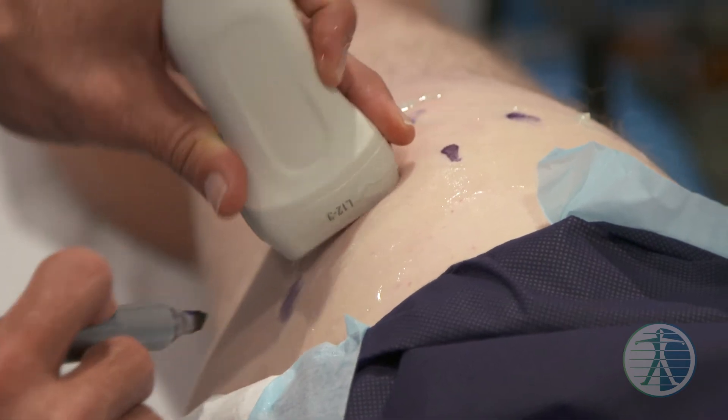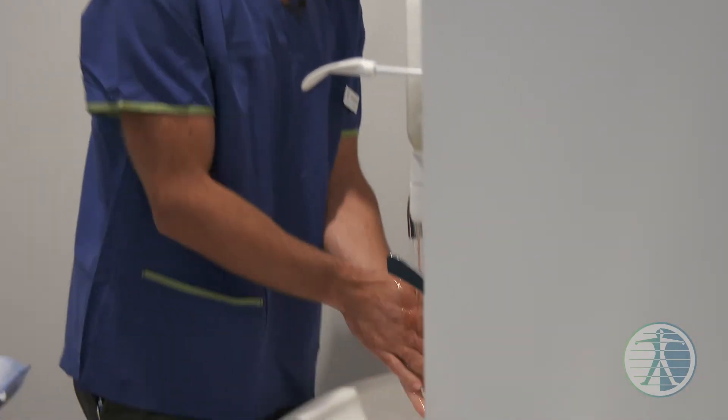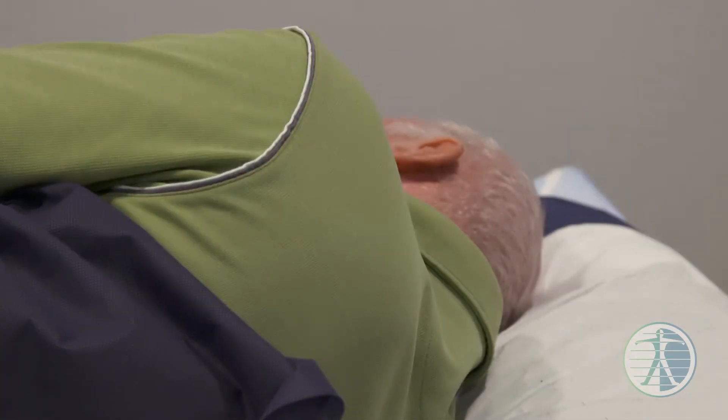Righto mate, I'll wash my hands and we'll get started, okay? So what I'll do is apply some local anaesthetic.